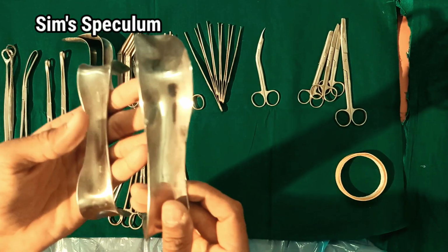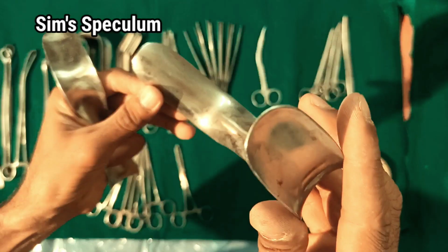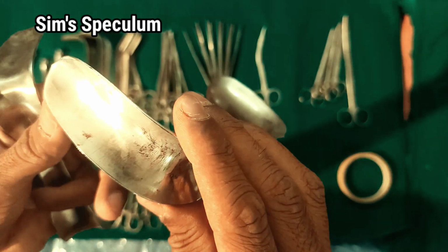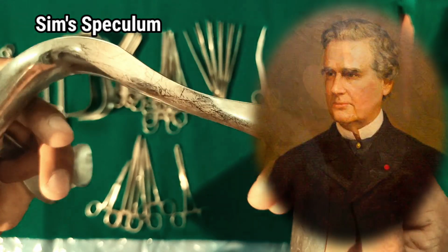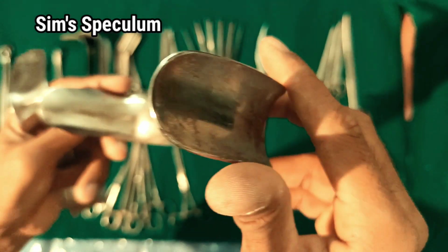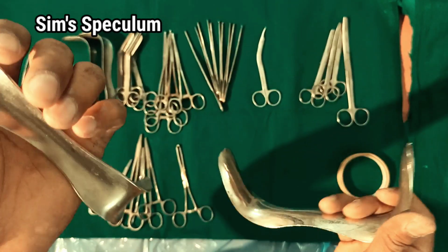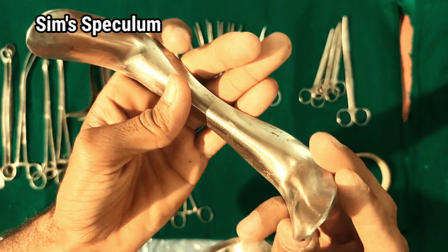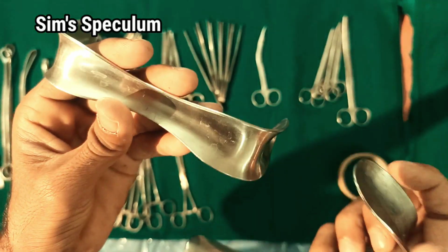Sims vaginal speculum. In gynecology, Sims vaginal speculum is a double-bladed surgical instrument used for examination of the vagina and cervix. It was developed by J. Marion Sims out of a pewter spoon, but nowadays it is manufactured out of stainless steel or plastic. The plastic speculum is disposable, but the stainless steel one is not. Therefore, the stainless steel speculum should be sterilized before each use.